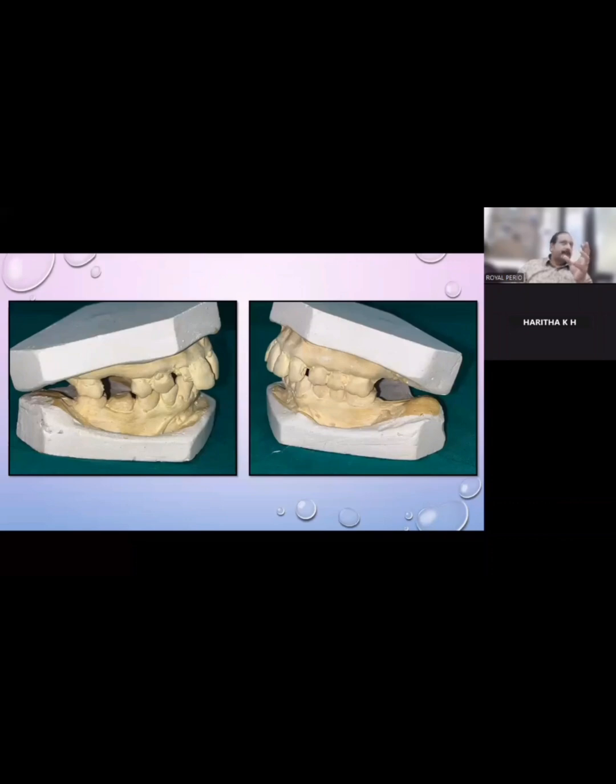3 millimeter. Stop at 3. If everything is okay, you can still go in for a drill, right? But if you go in for a 3.5 drill, and if the density is less, the final implant might not get the enough primary stability as what you desire to get. So let's fix it as 3. So the pilot, then 2.8, then 3. Stop it there. So once you reach 3 into 6.5, what's next? Expansion. Oh, you mean the osteotomes. You want to go in for a sinus lift with expansion and lift. Okay, which all osteotomes do you have?